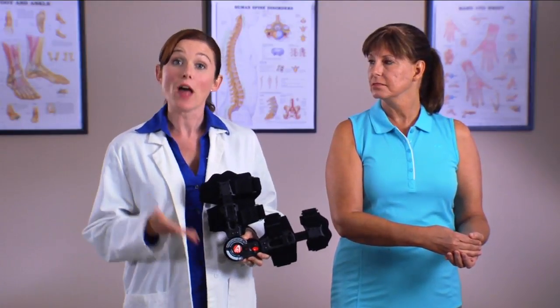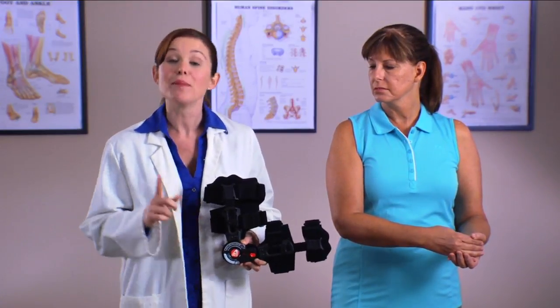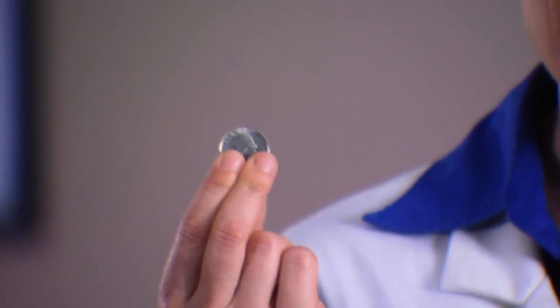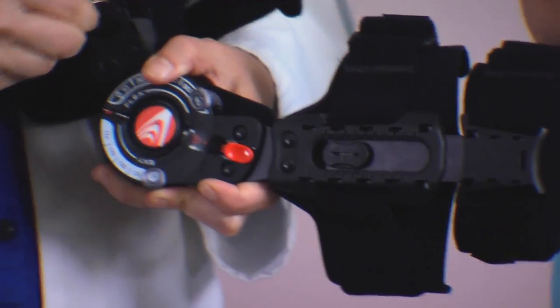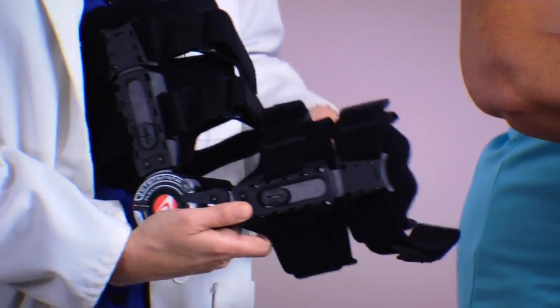Now let's fit the T-Scope Elbow Premier Brace on the patient. Unlock the telescope locks on the forearm and humeral bars by rotating the locks in a counterclockwise fashion. It's suggested that you use a quarter to rotate the telescoping locks. Then, unfasten the straps and fold them back onto themselves so they don't tangle.